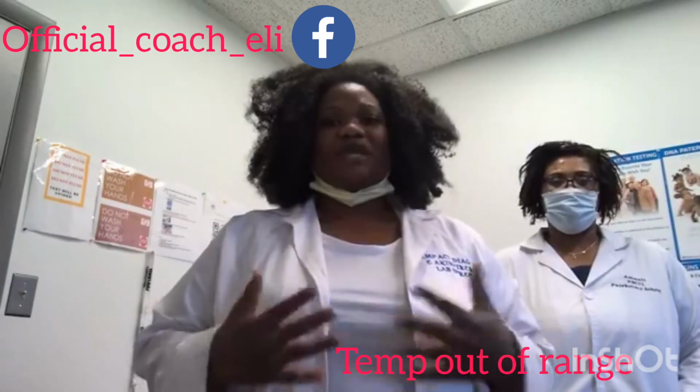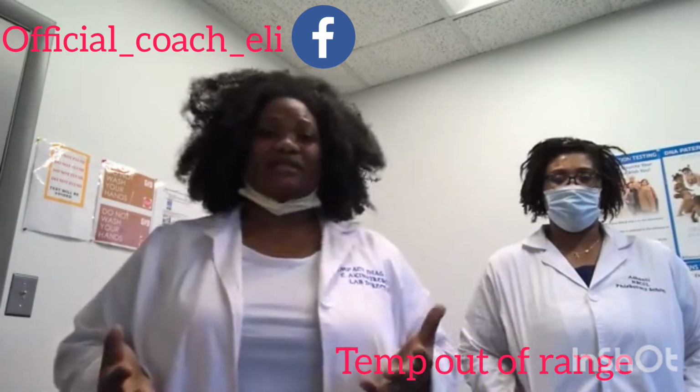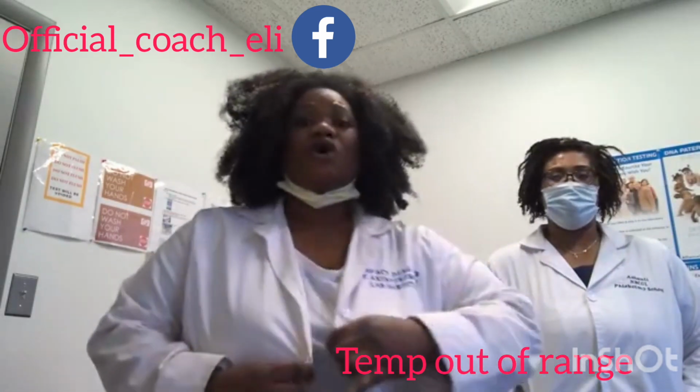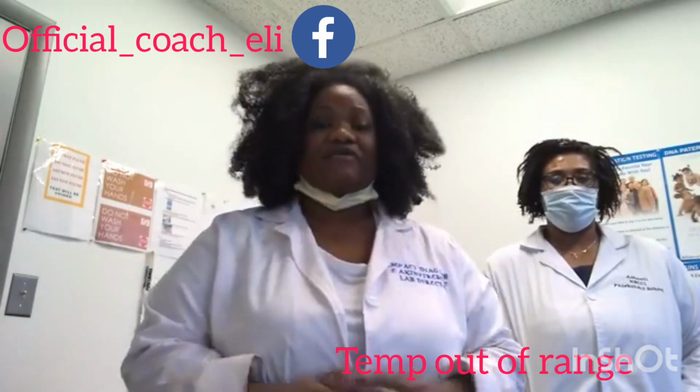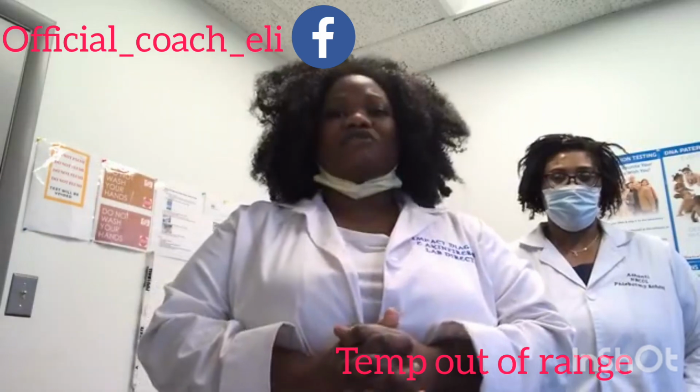We can't rely on that type of test. We don't know why it's out of range, so we will do another test to do the direct observation. And in this scenario, in this video, I am going to be capturing both.